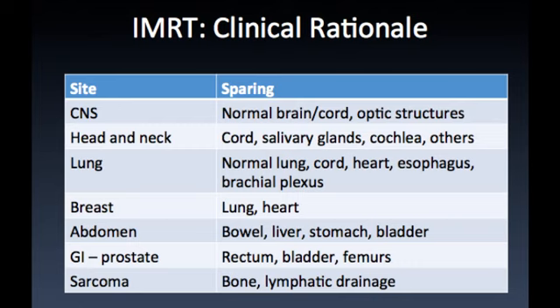So these are some of the places where IMRT has a role, and it's not a simple technique, so it took a lot of technology and effort to develop, but that was done for good clinical reasons. It provides benefit to the patients. And it's actually hard to prove that in a randomized trial because those are hard to run.